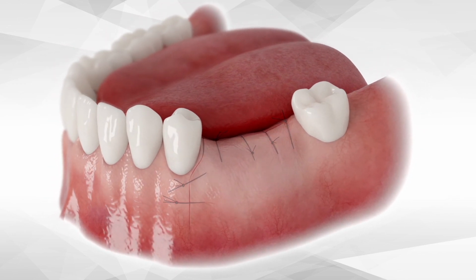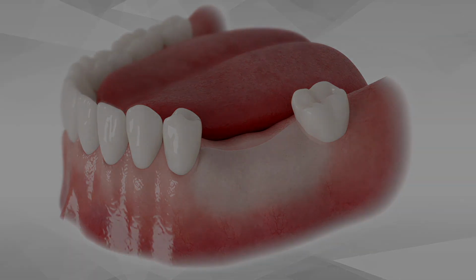Primary closure is not mandatory. Up to 3 mm of incision line opening is completely acceptable. No membranes or PRF between the flap and the Bond Apatite cement, and no provisional removable appliances are to contact the graft site.